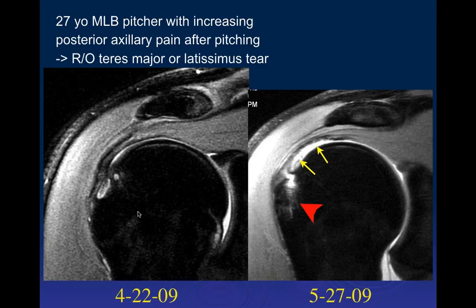With the arthroscope, what you have to do is put more weight on the arm to get more visualization, and abduct the arm more to get to that area. That's not an easy area to see. I think, if I may say so, with a little extra effort, that should have been seen. I don't think that, I think that was torn from the get-go.